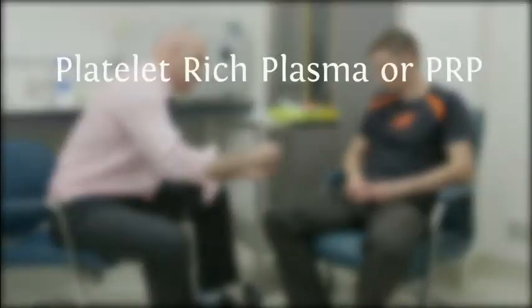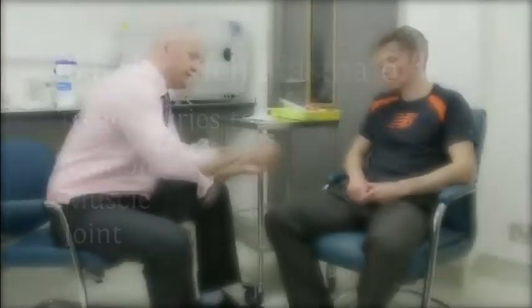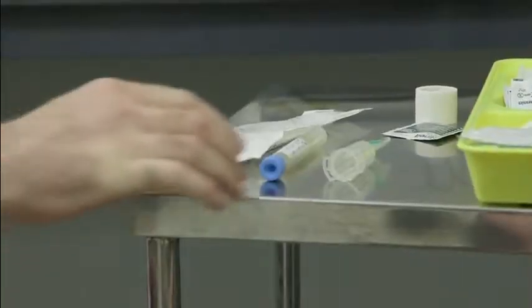Platelet-rich plasma, or PRP, may be used by your sports and exercise medical physician to treat injuries to tendon, muscle, or joint. To prepare platelet-rich plasma, you will be taken to a preparation room where your physician will explain the apparatus used and the procedure planned. This is a good time to ask any questions you might have.